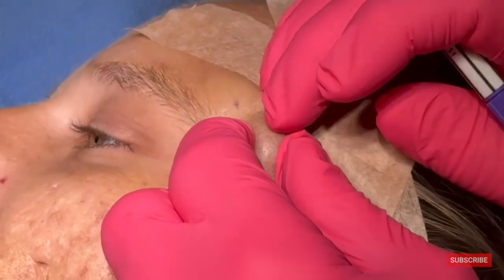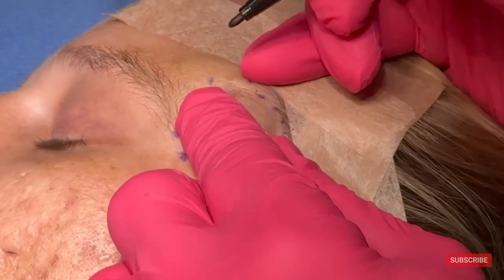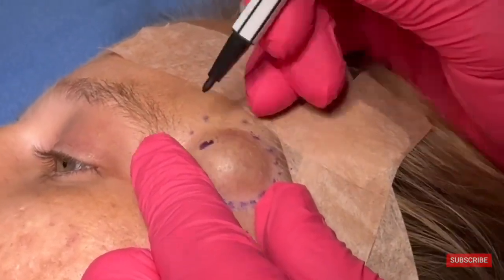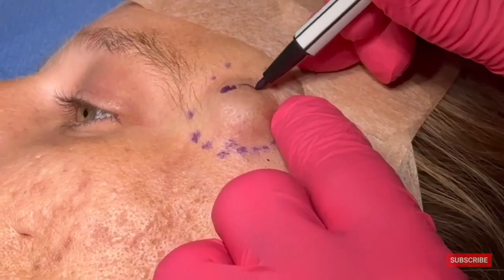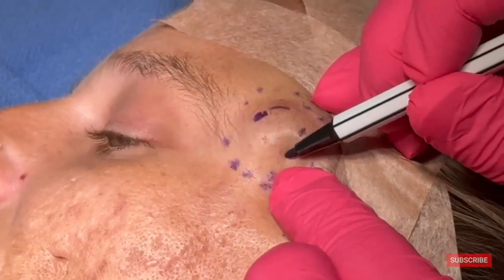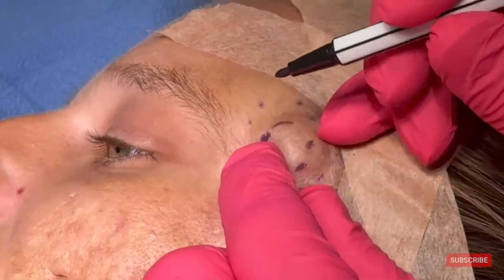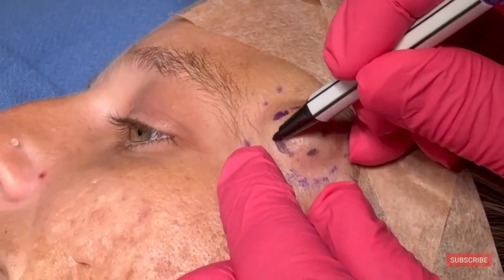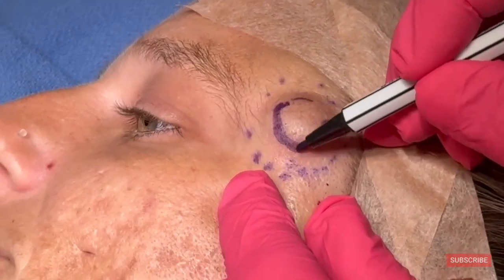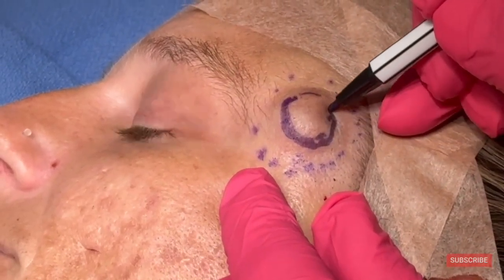The trick to these surgeries is to have a finger as an eye, and to first get the boundaries of the cyst, and you want to feel everywhere. Because when something is under the skin and it lifts the skin off, it easily fools the observer into thinking that it's actually all of this. The cyst, this is its boundary.